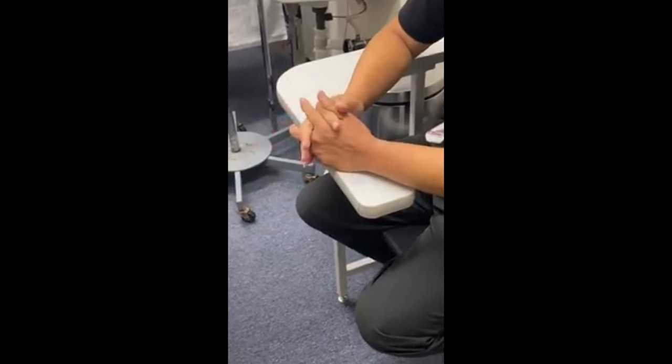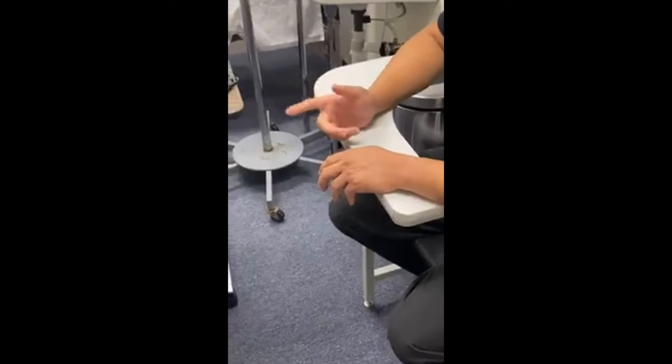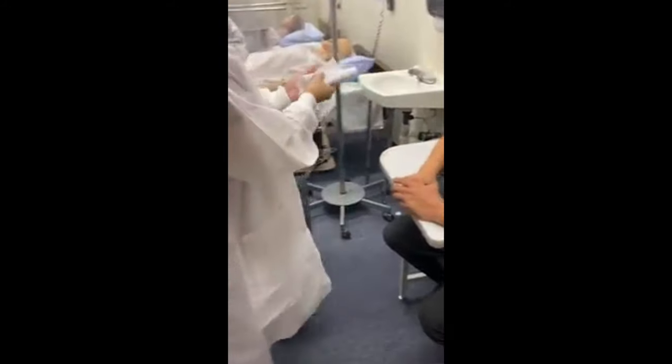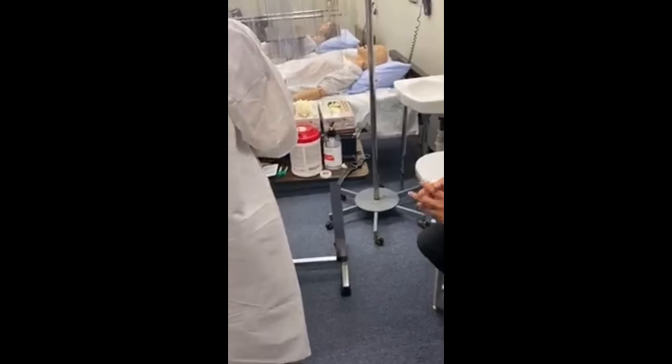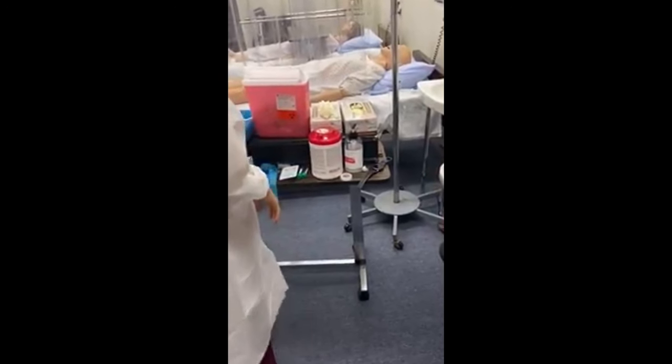Again, right? Oh, but this one, no, you don't have to. Oh, okay. Because usually when you sanitize, it makes it hard to put on gloves. So, you can just wipe it out. And then once you find the vein, you can just go straight to the gloves. So gloves have to be worn when you clean the site. Okay. Gloves. Okay.